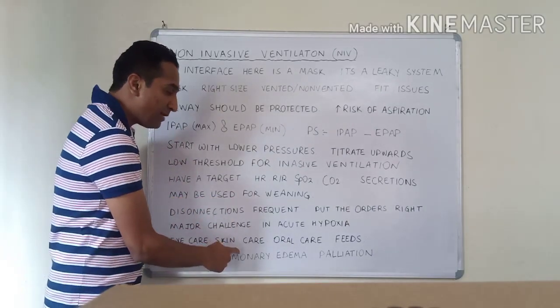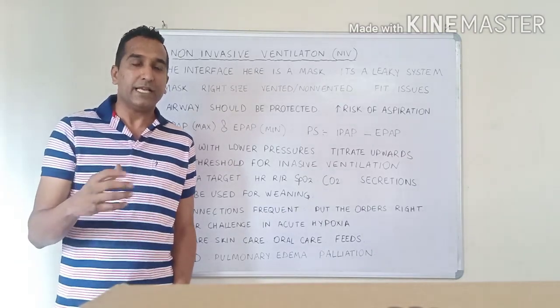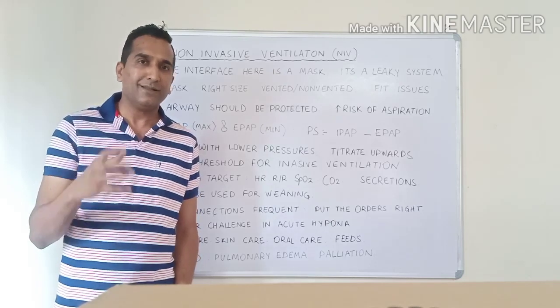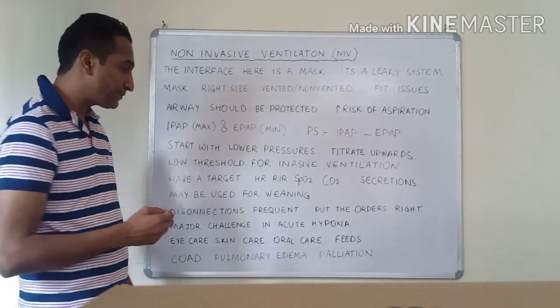In acute pulmonary edema, the other thing is if it is cardiogenic pulmonary edema, the response is also dramatic. So you may apply an NIV, leave it for a small period of time, an hour, 2, 3, and you may see a turnaround. That gives sometimes a diagnostic clue that probably my patient had cardiogenic versus non-cardiogenic pulmonary edema.